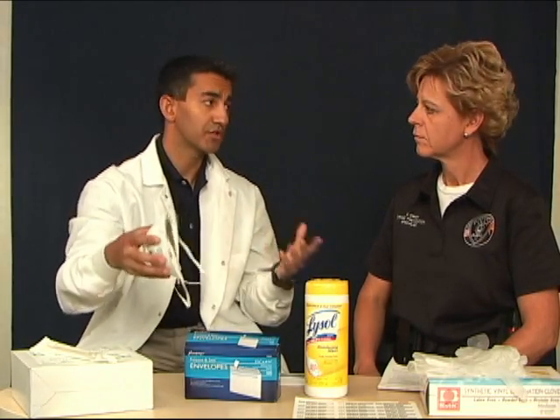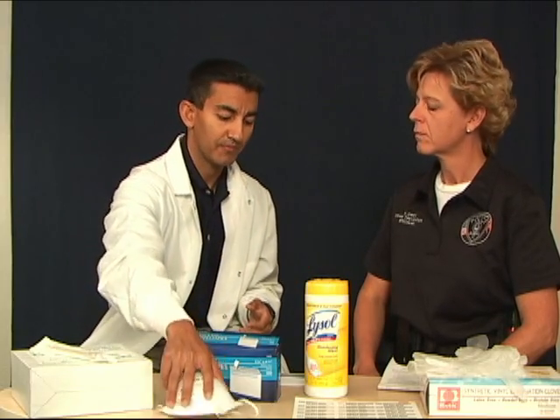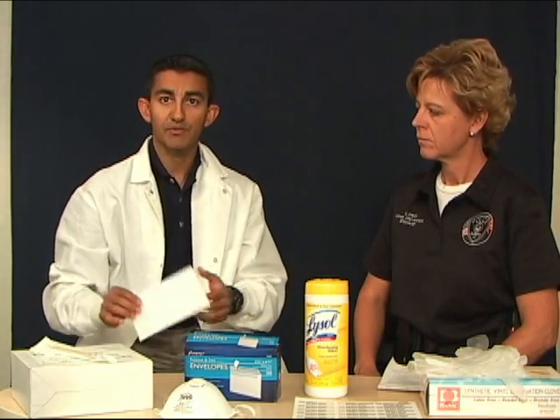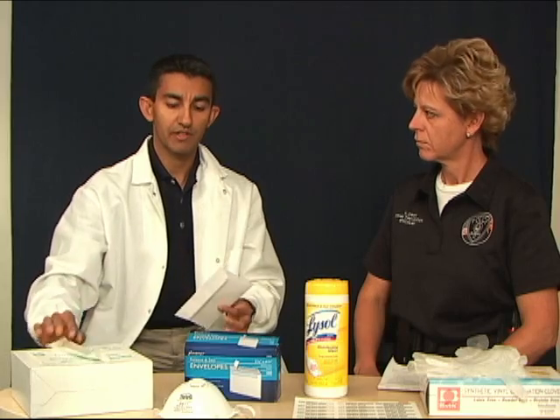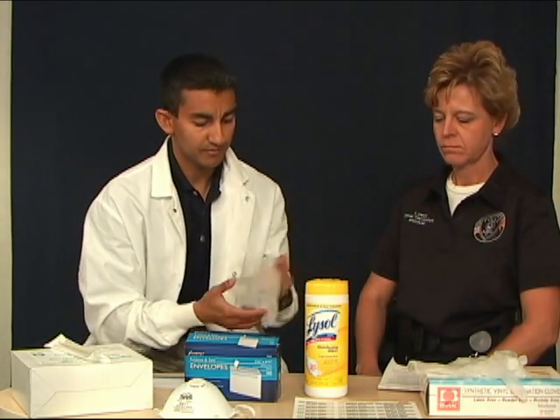For demonstration purposes, I'm not going to wear a mask so that I can talk and it doesn't sound muffled through the mask. You want to have your supplies ready, your envelope, your kit, everything, so that you don't have to sit there and fiddle and touch too many things. So let's put our gloves on.